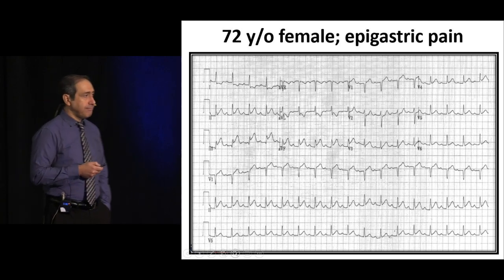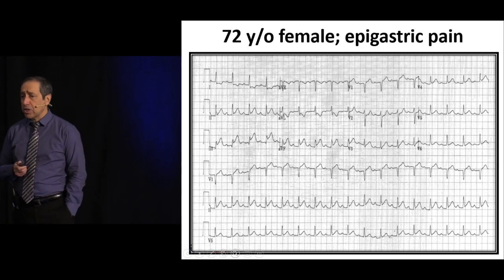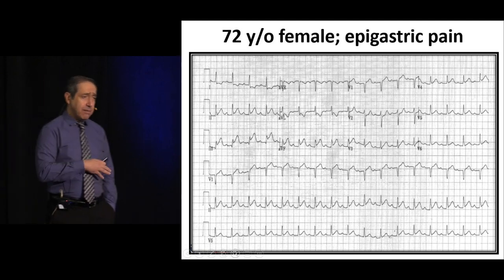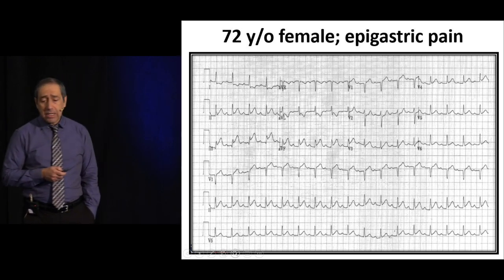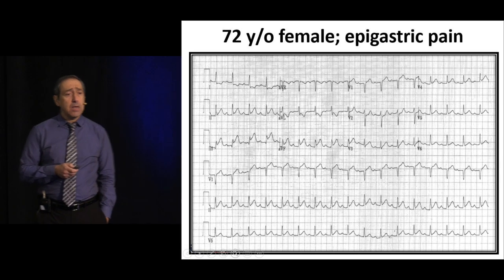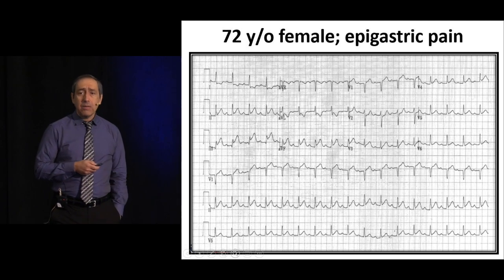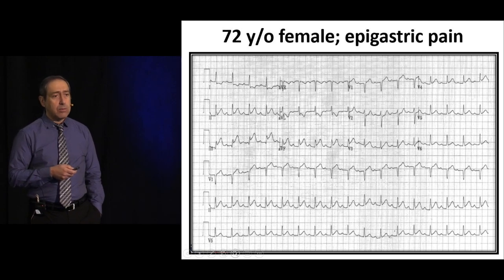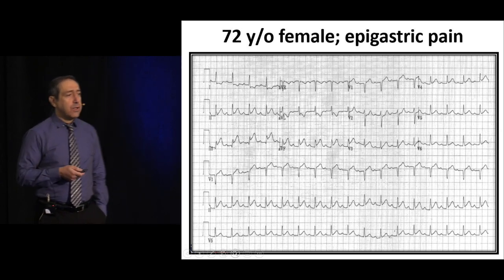This is very likely inferior MI. We looked for reciprocal changes. Whenever you have inferior MI — something you'll see very commonly in clinical practice — look for right ventricular and posterior involvement. On the same EKG, your eye should go next to V1. Do we have ST segment elevation in V1? That tells us the right ventricle is involved. If you already have it in V1, there's no need to get right-sided leads.